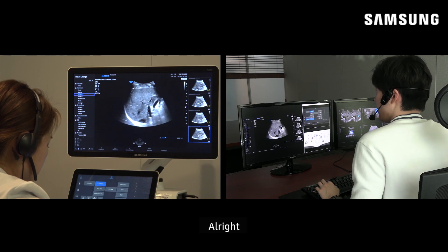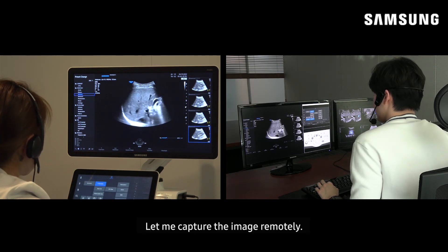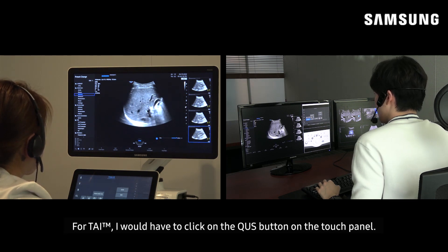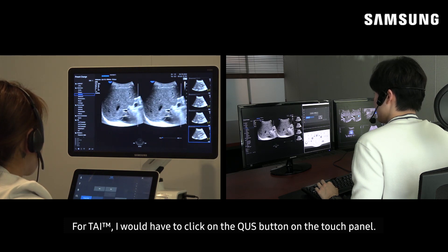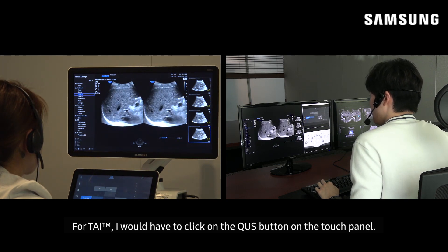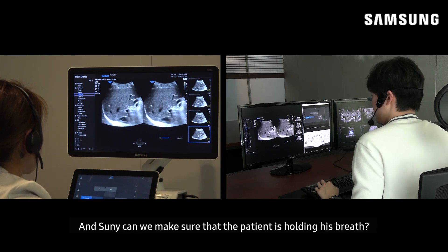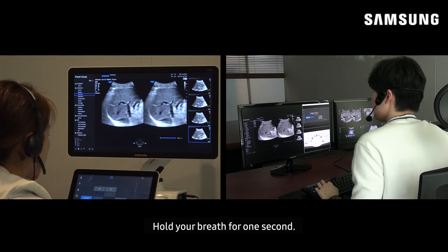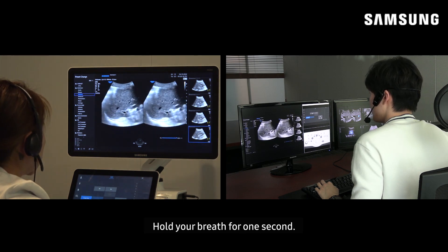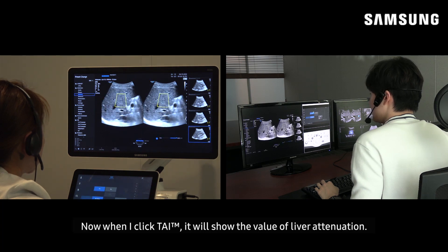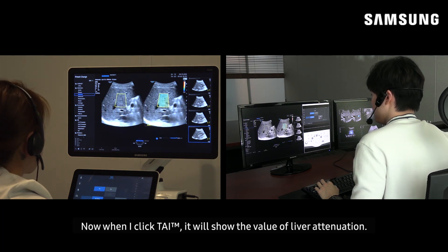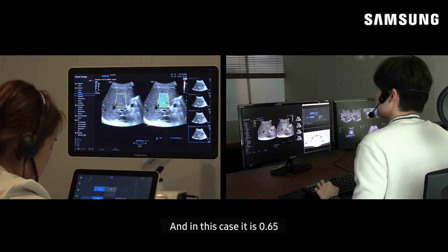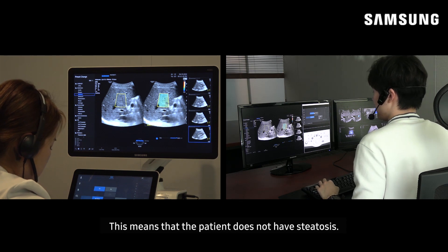Alright, let me capture the image remotely. For TAI, I would have to click on the QUS button on the touch panel. Ms. Sunny, can we please make sure the patient is holding his breath? Hold your breath for a second. Okay. Now when I click TAI, it will show the value of the liver attenuation. In this case, it is 0.65. This means that the patient does not have steatosis.